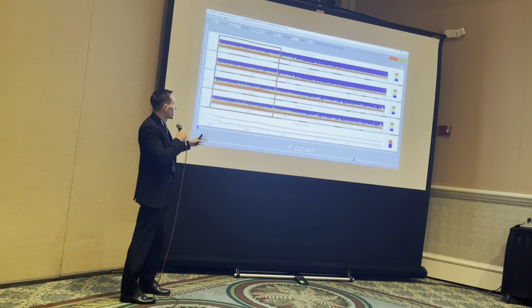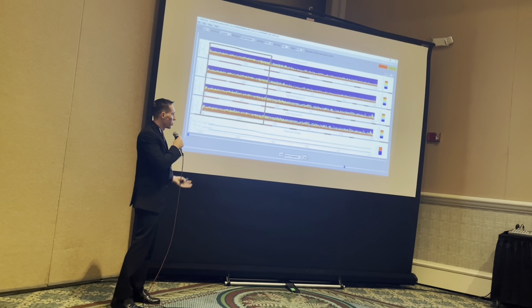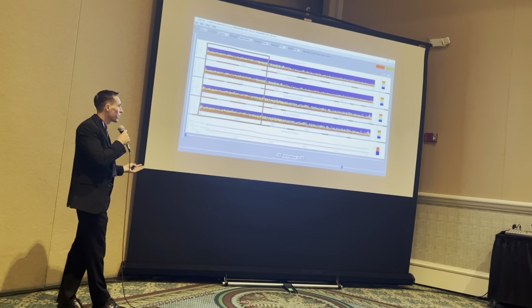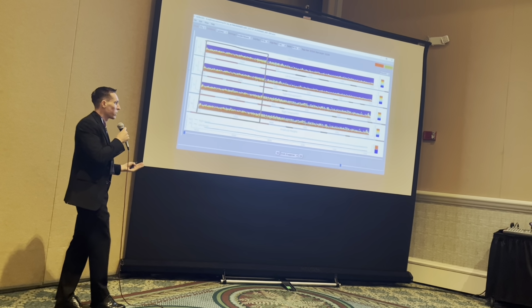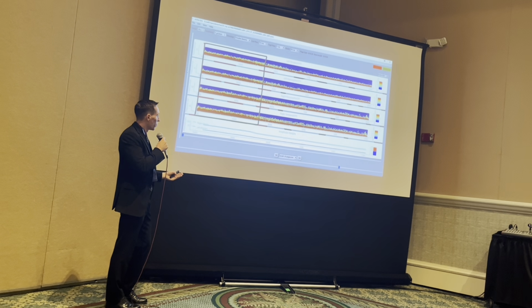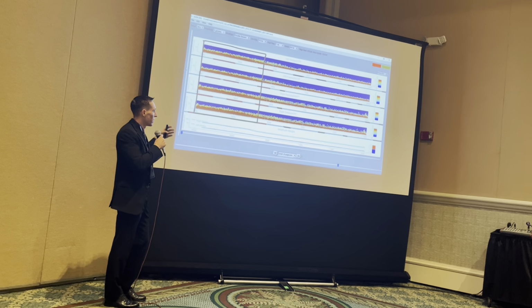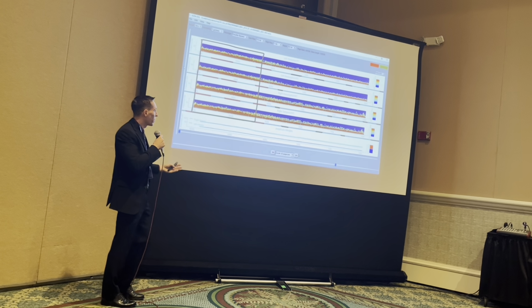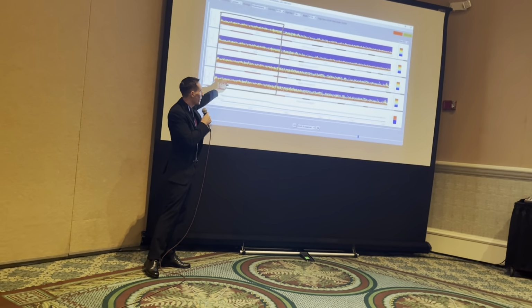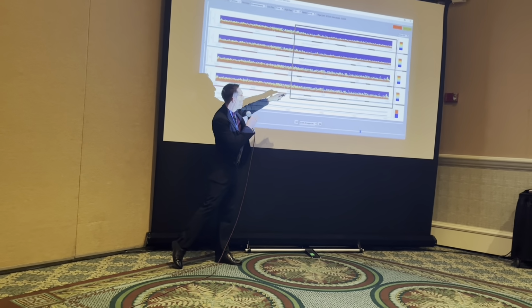When this patient was having this seizure, they were able to call the neurologist. The neurologist looked at the record, and the nurse was able to administer some Ativan to the patient, which got rid of the high amplitude rhythmic delta theta and the sharp waves, and then the pattern changed from this broadband pattern right here to more of a narrow band pattern.